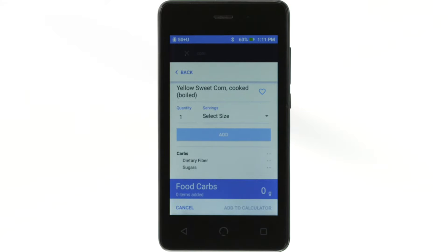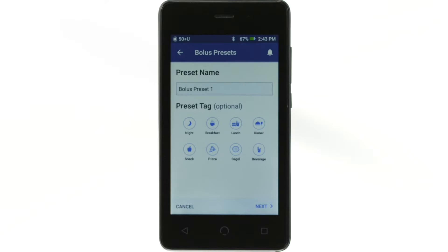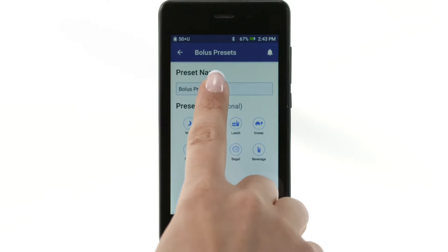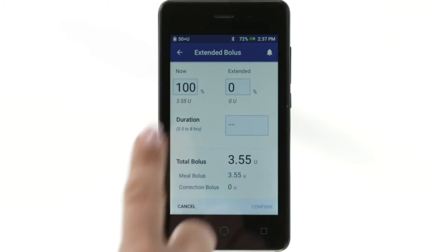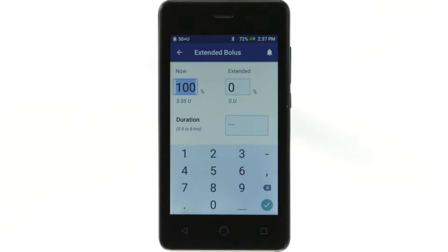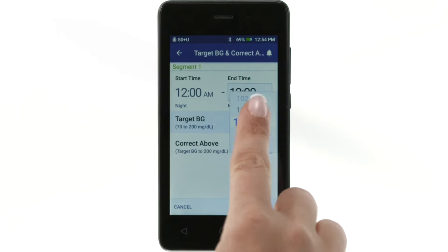Fields that you can edit are either underlined or framed by a box. To edit them, tap the field. This opens a keyboard, number pad, slider, or scroll wheel.